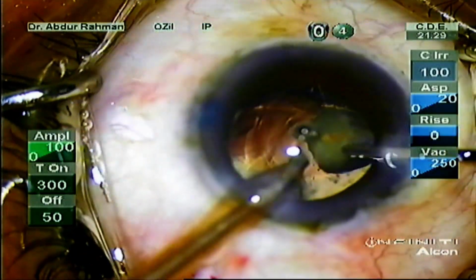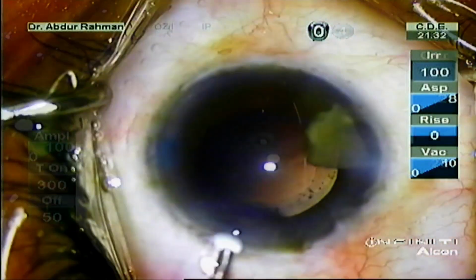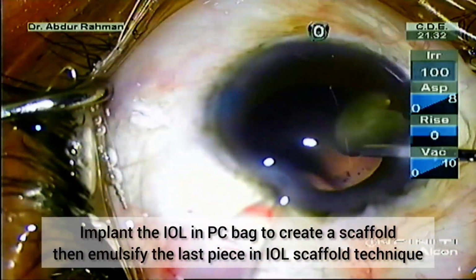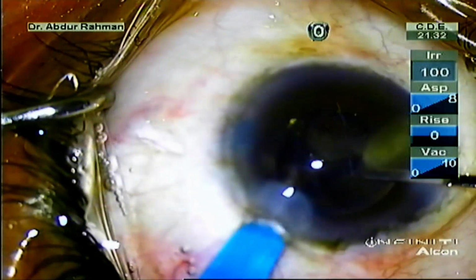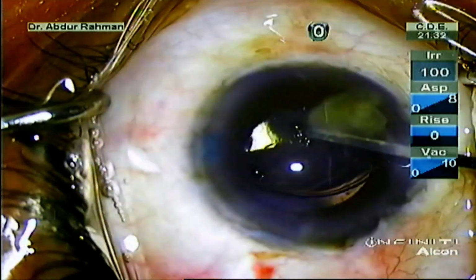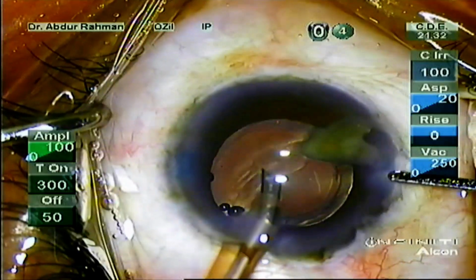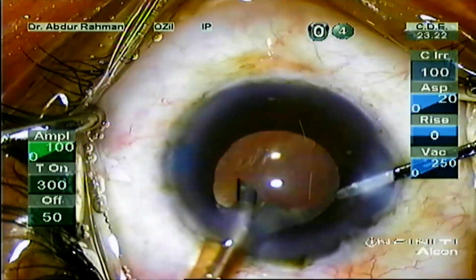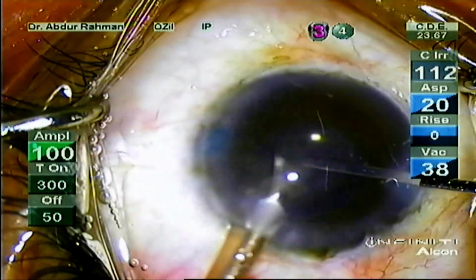I'm maneuvering this piece into the anterior chamber, and I'm keeping it at the angle, and I'm replenishing the AC with OVD, because I will implant an IOL in the capsular bag, because I want to perform IOL scaffold to remove this last piece. Now this IOL is protecting the posterior capsule. Now I can easily emulsify this chopped piece without any fear of PCR occurring.